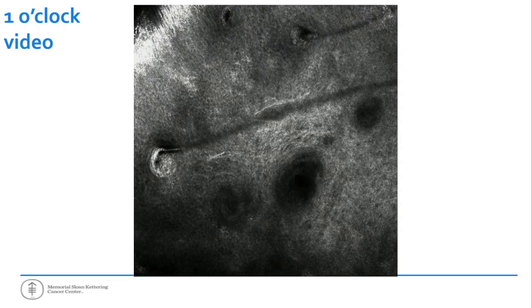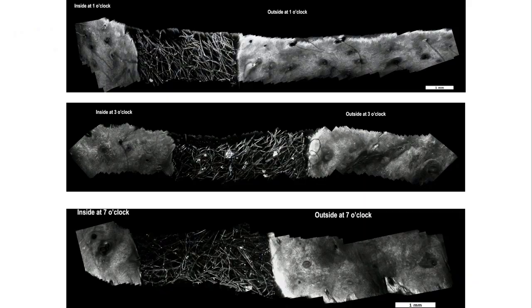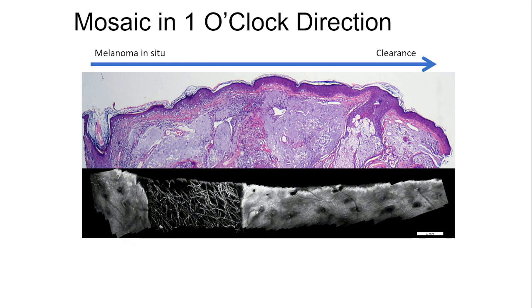And we stop when we think that the margin is clear. And for many people, they're like, oh, well, why do you need that? You could just take margins clinically. But for the patient, they want to save every millimeter of skin possible, right? Because it's their face that's getting cut. And we can use these in direct correlation with the histology from the specimen that we remove.